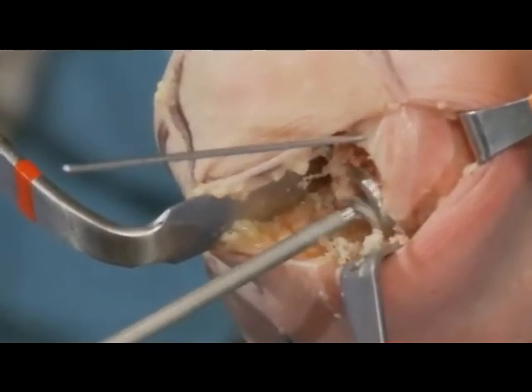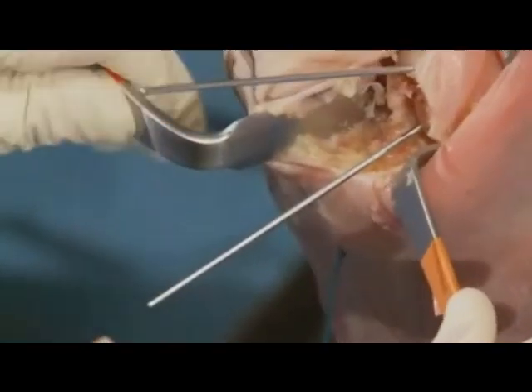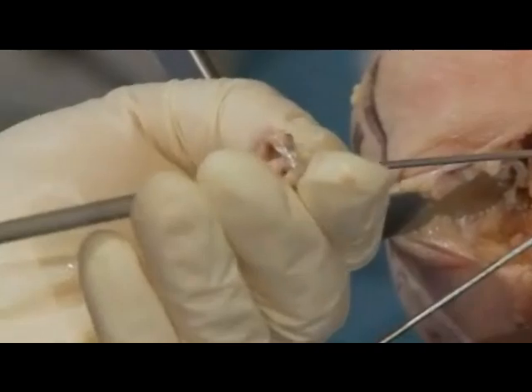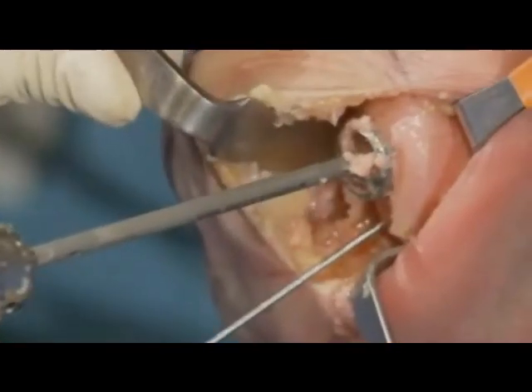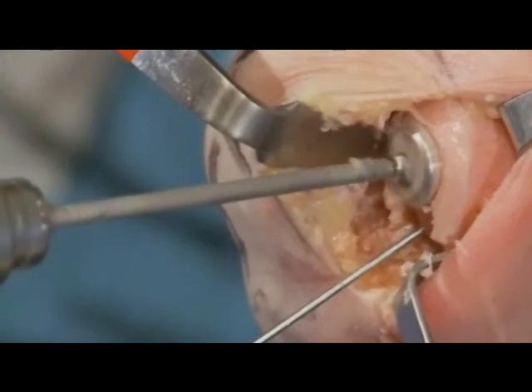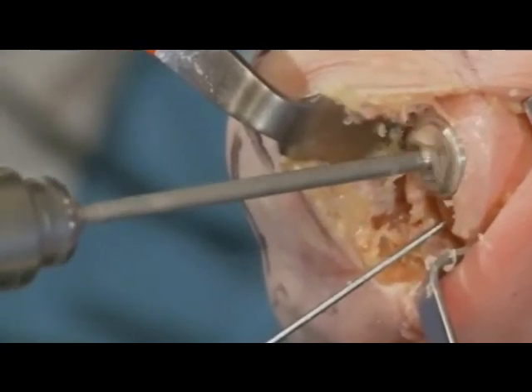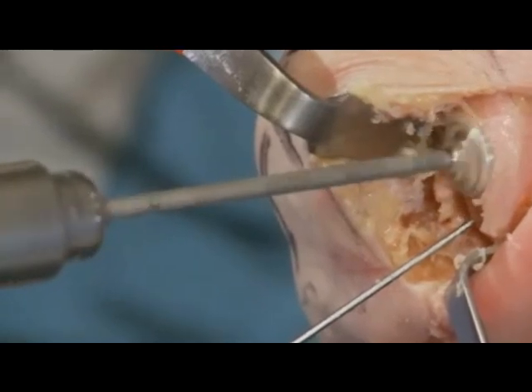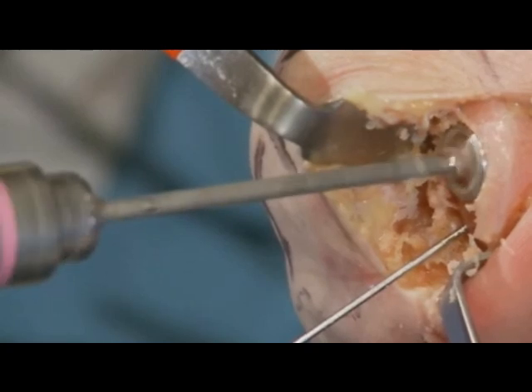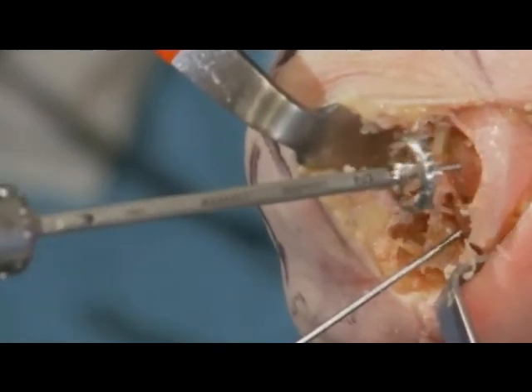You can feel it, a very soft bone, so you have to be careful. Now we move to the top wire, and we have to do the same thing. It's the same drill because it's symmetrical medial lateral. And again, we look through the fenestration of the window. And you can see the wire coming up in the hole. And there you can see, there it is. It's met now. The wire's all the way through. I think you can see that on the screen, okay?